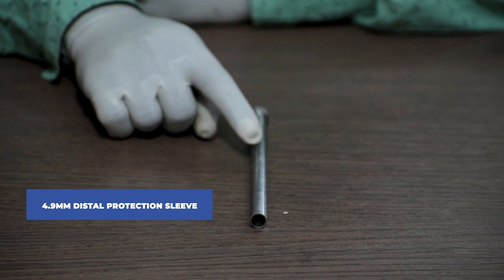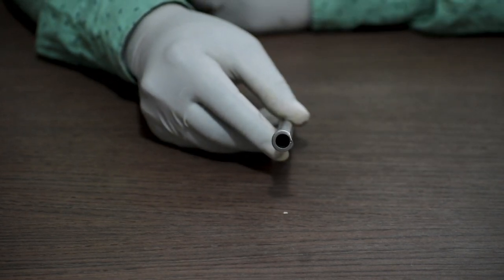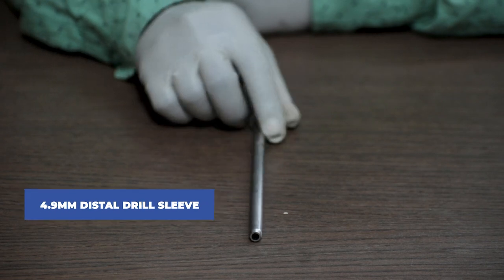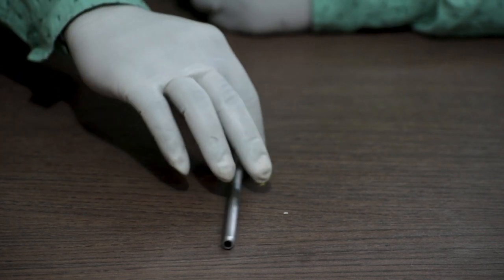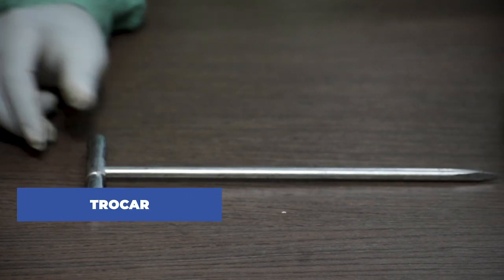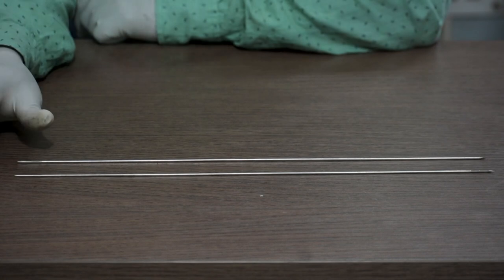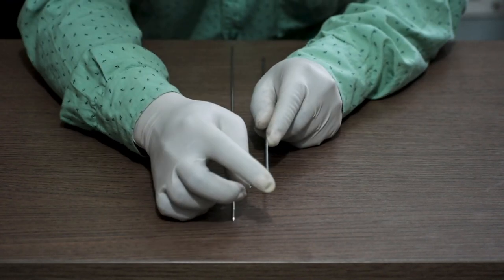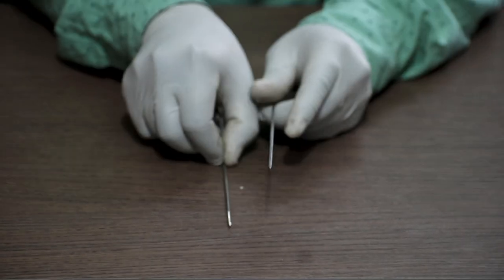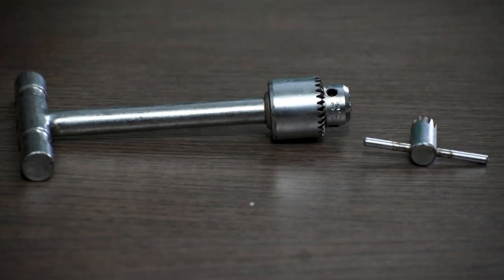Next, the 4.9 mm distal protection sleeve. This is called a kalker. Next are the 2 mm guide wire and 2 mm guide pin. You can differentiate between the two by the availability of the thread — the threaded one is a guide wire and the normal one is a guide pin.